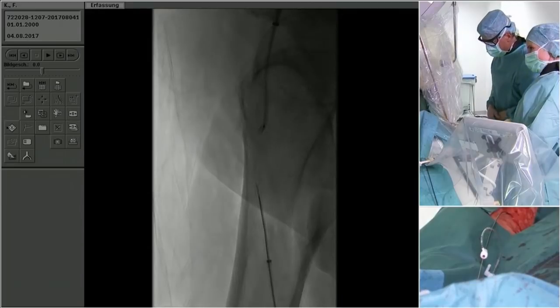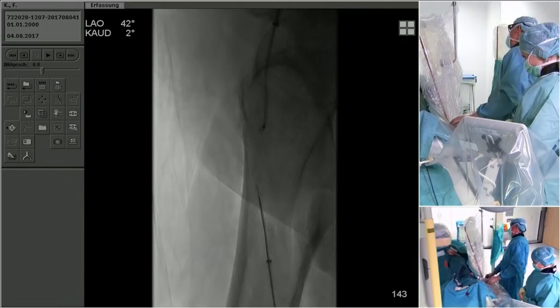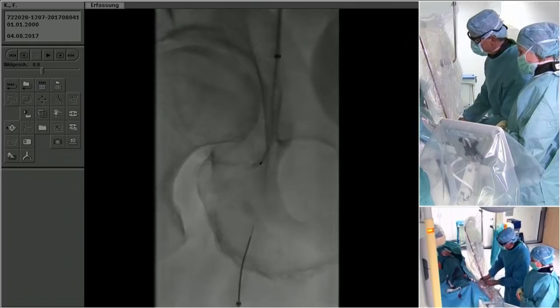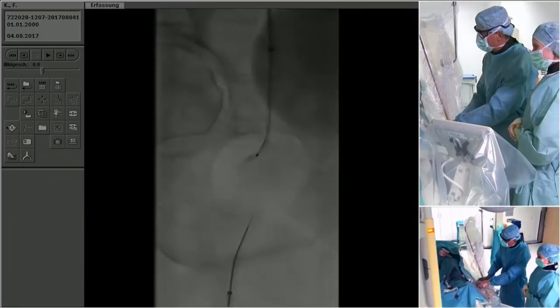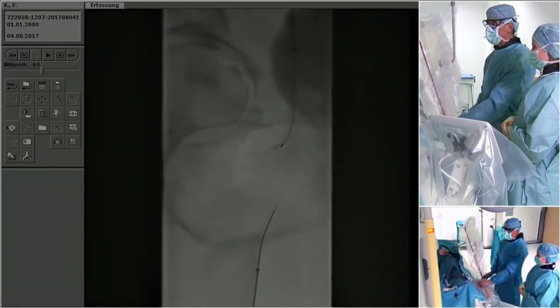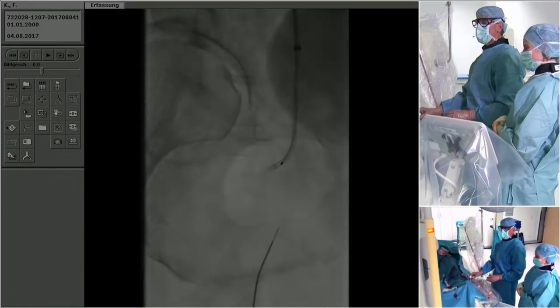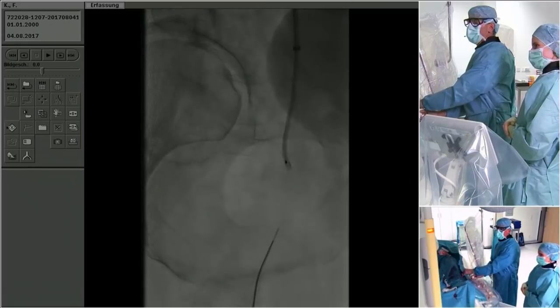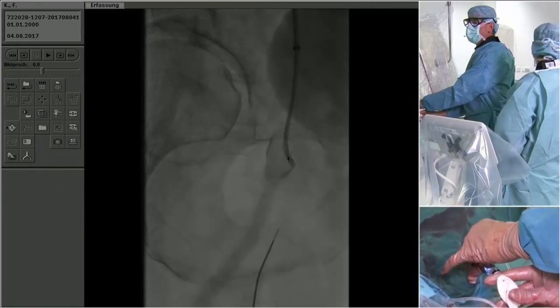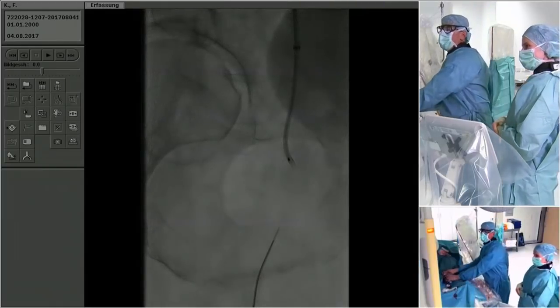So are you straight away advancing the needle? Once we have treated this. I was straightly advancing the needle now, and now, of course, I have to start to do this in different angulations, to change the direction of the needle until I really reach an area where I want to go to. In fact, in this case, I find it not so easy to position my catheter from antegrade properly. Maybe here. Yeah, actually, so here it looks good. Yeah, that looks good. Yeah. I like this here.